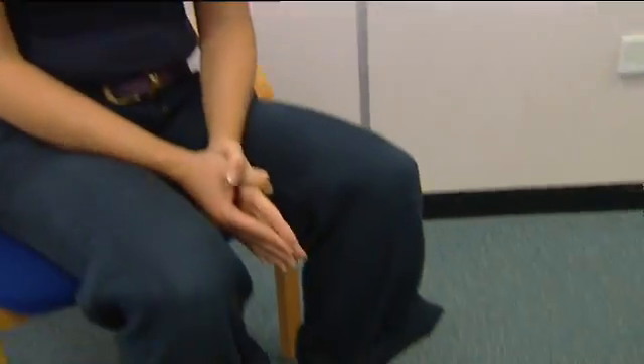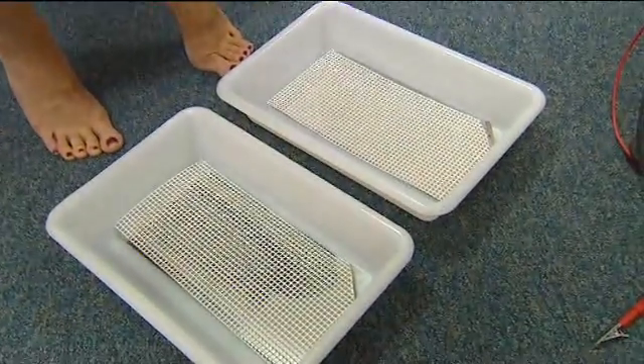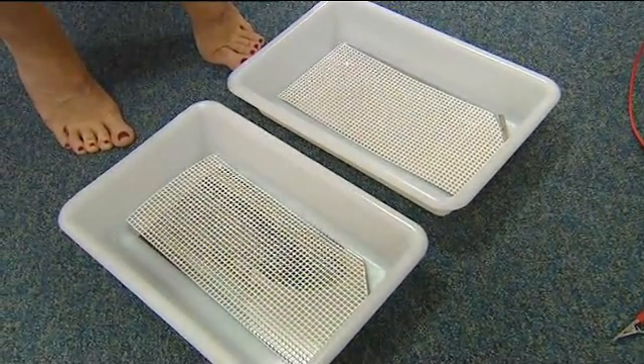I will now show you the process for treatment of the feet only. The treatment is the same as for the hands, but with both baths placed on the floor, the hands will be free to manually adjust the current by pressing the up and down arrows on the machine.